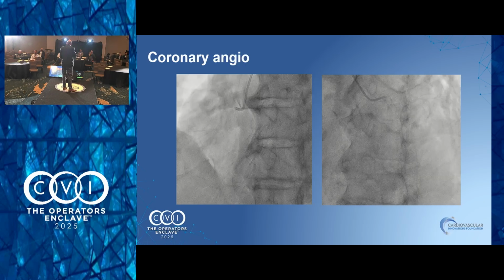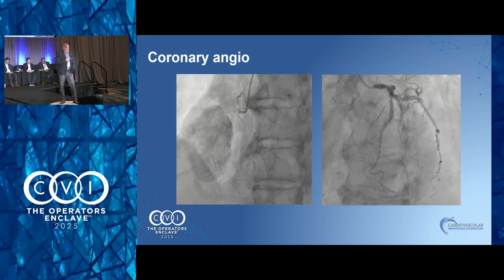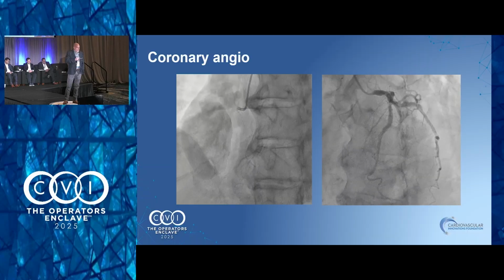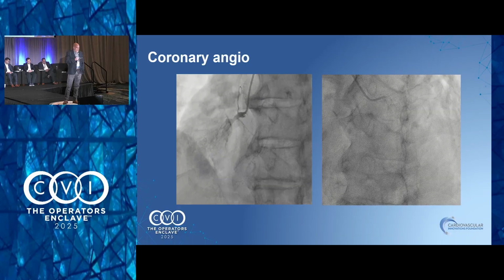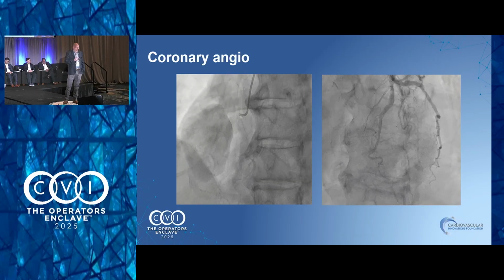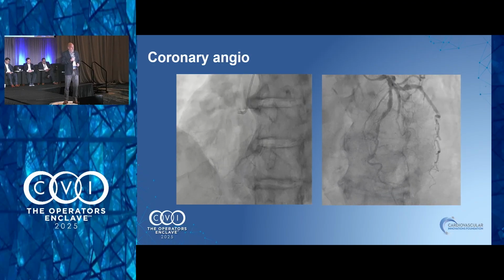But here, of course, you got an angiogram. And this is what we see. You can see this large mass. Obviously, contrast is spilling into it. And very calcified distal right, you see that. But it seems to be filling a little bit, I think, although the CT suggested there was no filling of the distal right, no collaterals.